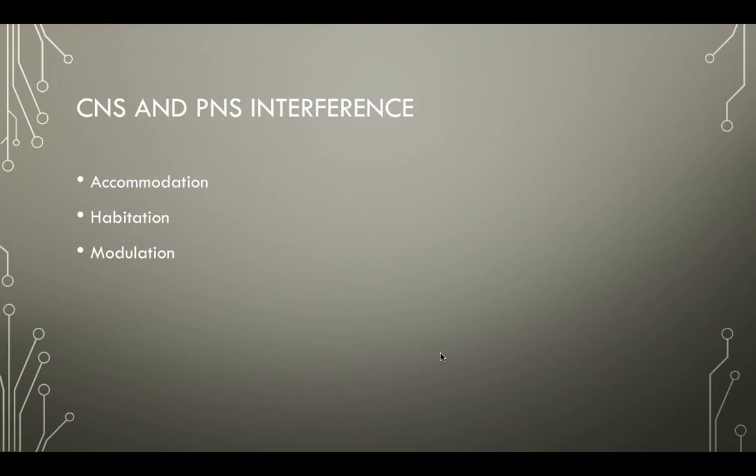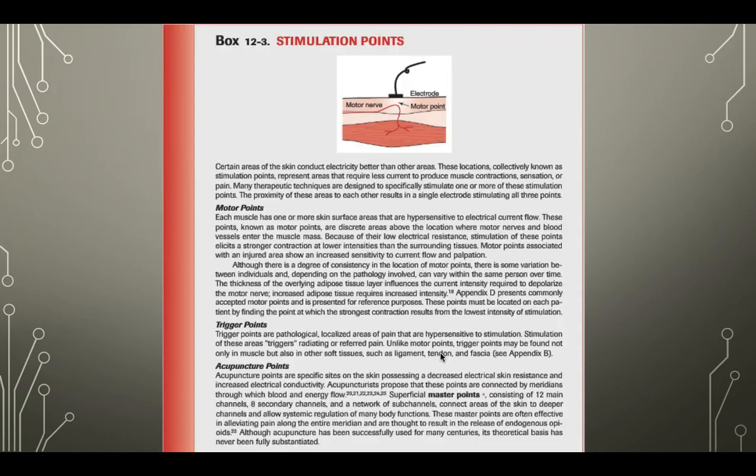So randomly altering the pulse intensity, the frequency, or the duration keeps the body guessing and keeps the flow of electrons and the membrane from being able to adapt. And so it reduces accommodation and habituation.